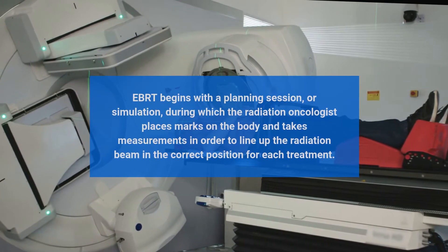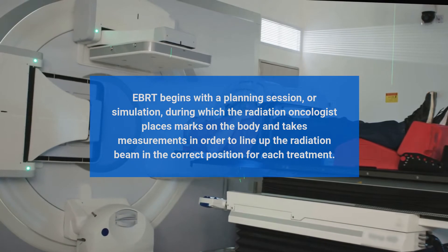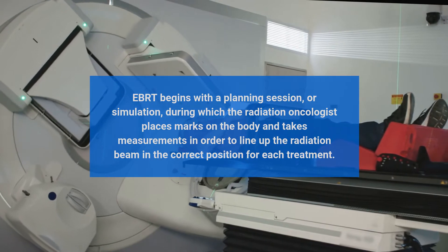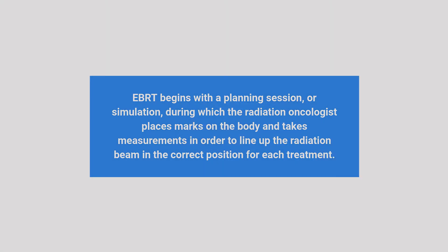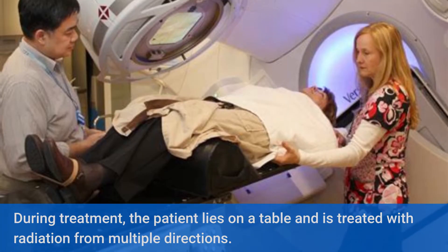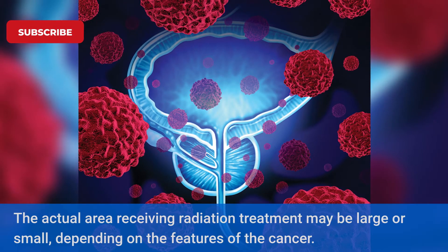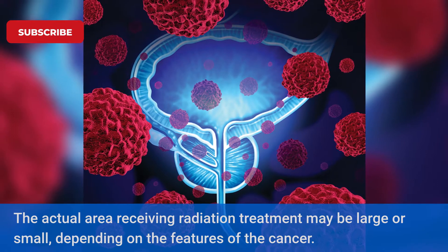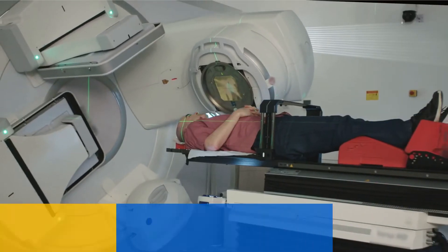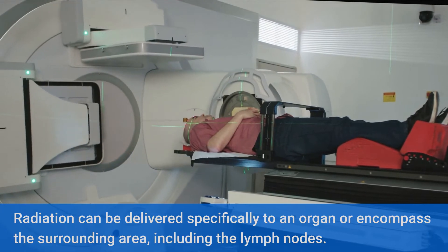Radiation therapy begins with a planning session, or simulation, during which the radiation oncologist places marks on the body and takes measurements in order to line up the radiation beam in the correct position for each treatment. During treatment, the patient lies on a table and is treated with radiation from multiple directions. The actual area receiving radiation treatment may be large or small, depending on the features of the cancer. Radiation can be delivered specifically to an organ or encompass the surrounding area, including the lymph nodes.